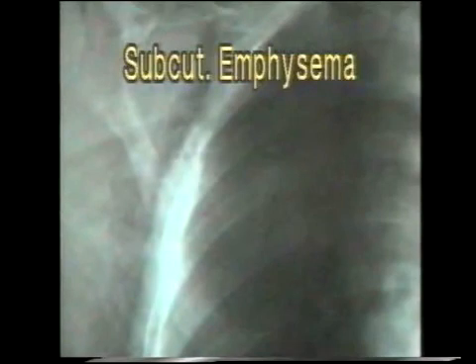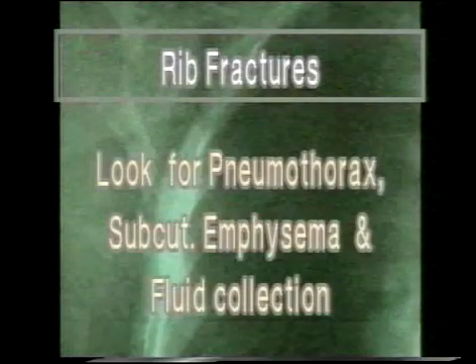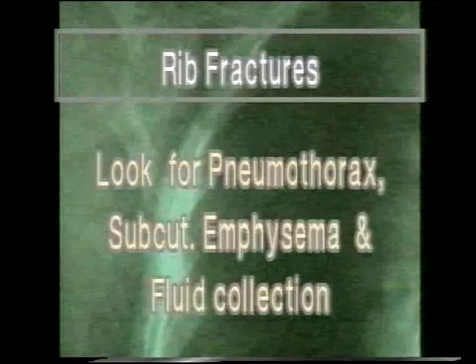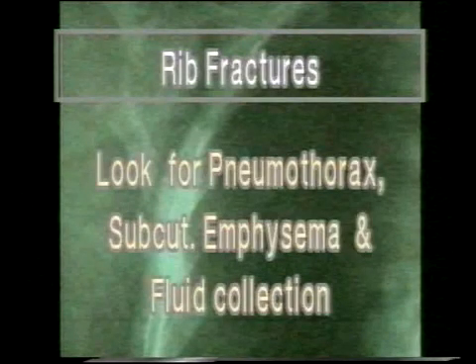So whenever you see an X-ray of chest injury with rib fractures, also look for pneumothorax, subcutaneous emphysema, and pleural fluid collection.